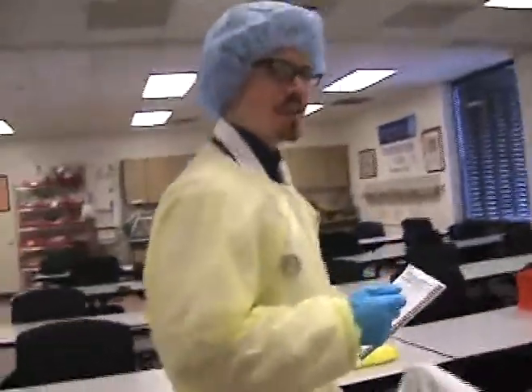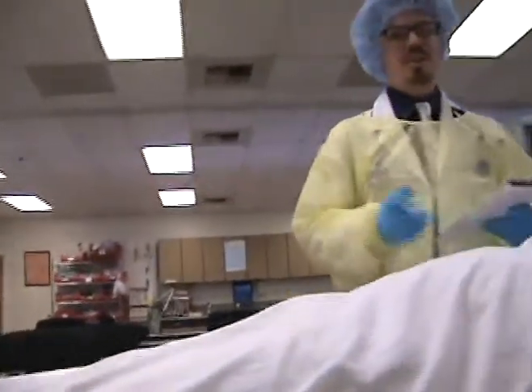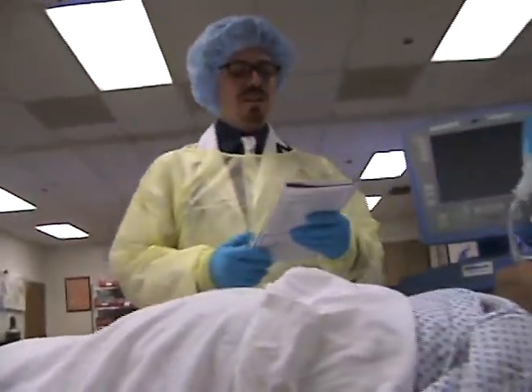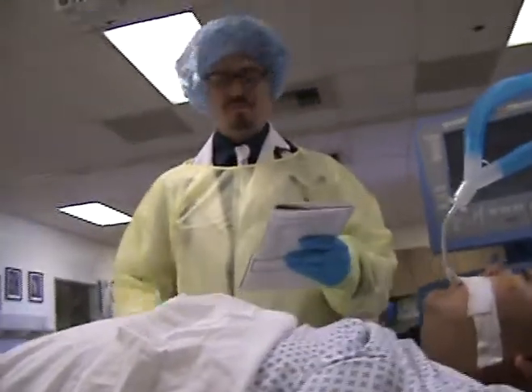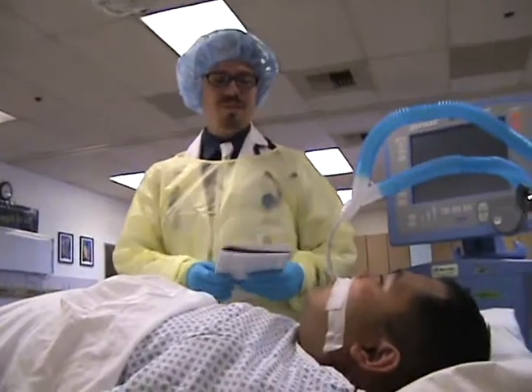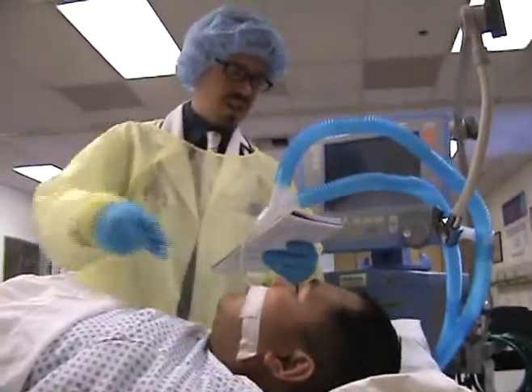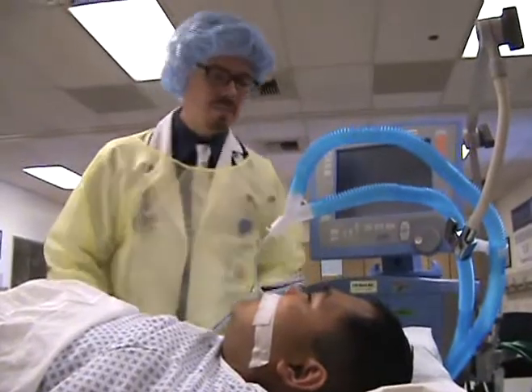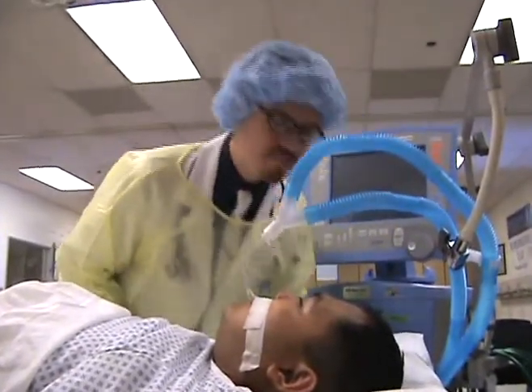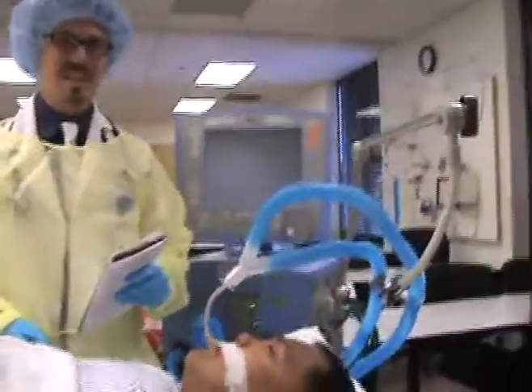Now we're ready to perform our vent check. We're on step four: assessing the patient. Some things you're going to want to assess for are patient color — this patient is a healthy brown — vital signs, level of consciousness, and of course, breath sounds.